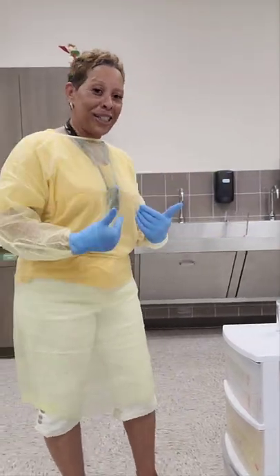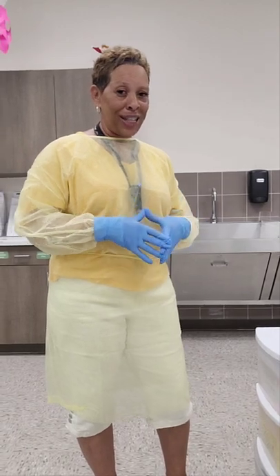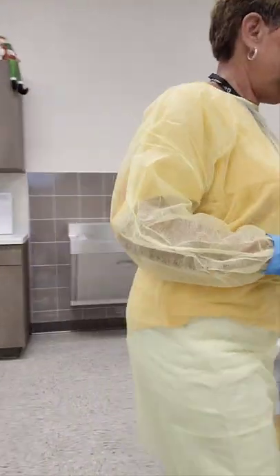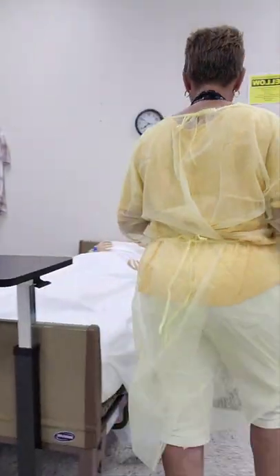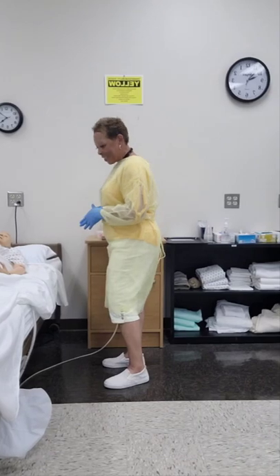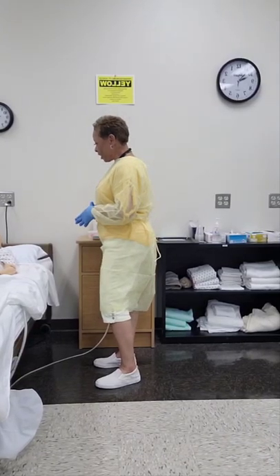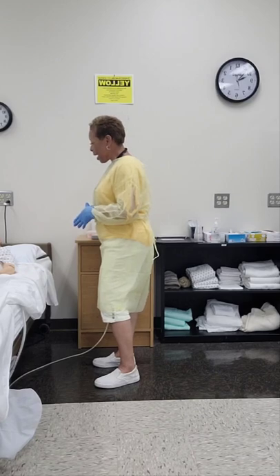Now that I've donned my PPE, I can enter the resident's room. Hi, good morning, Mrs. Jones. How are you? My name is Julie. I'm your CNA, and today I'll be emptying your urinary drainage bag and measuring and recording your urinary output.